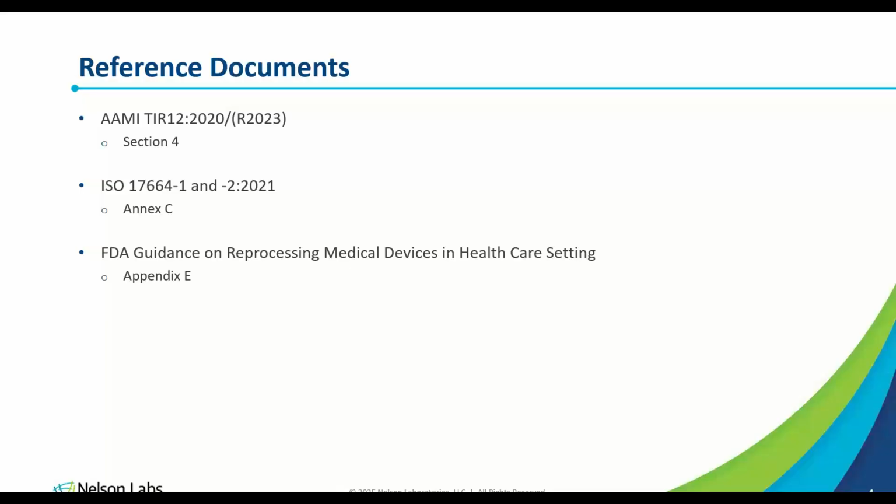These documents give lists of difficult to clean areas.